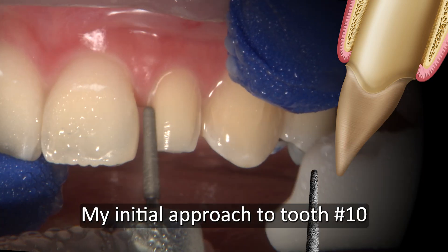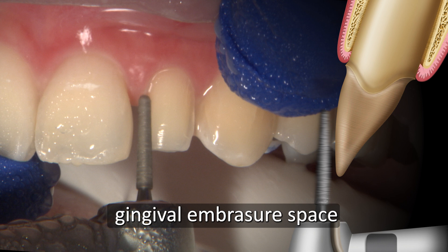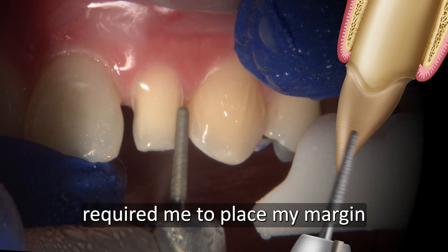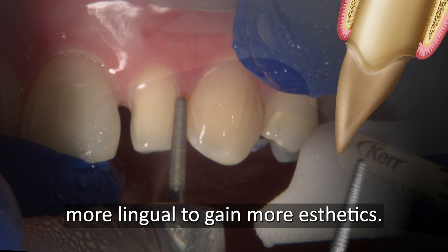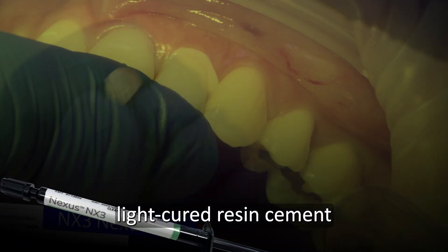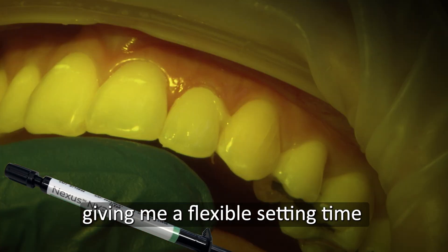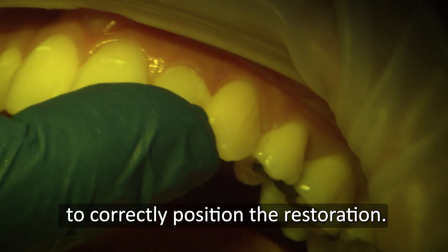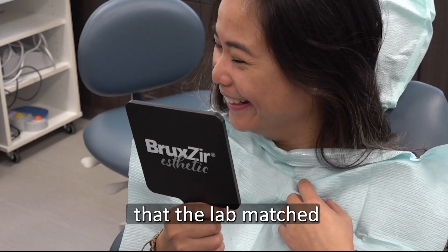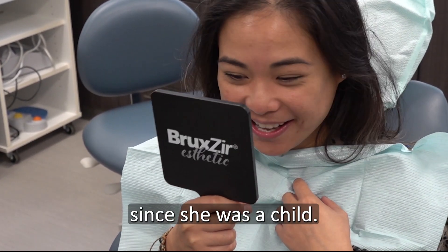My initial approach to number 10 was to restore it with a veneer, but the large gingival embrasure space between number 9 and 10 required me to place my margin more lingually to gain more aesthetics. I used NX3 Nexus 3rd Generation Light-Cured Resin Cement to bond the crown onto the prepared tooth, giving me a flexible setting time to correctly position the restoration. The results show that the lab matched the exact shade and shape that the patient had always wanted since she was a child.